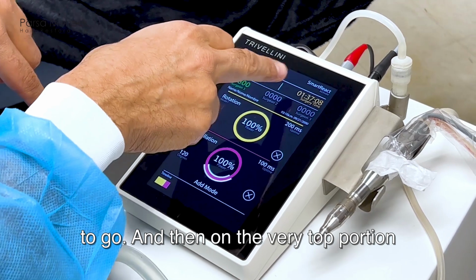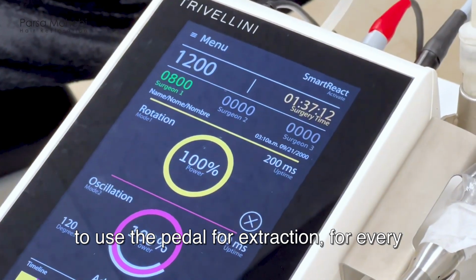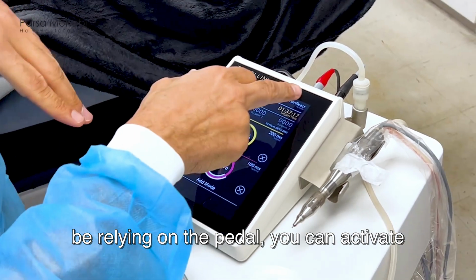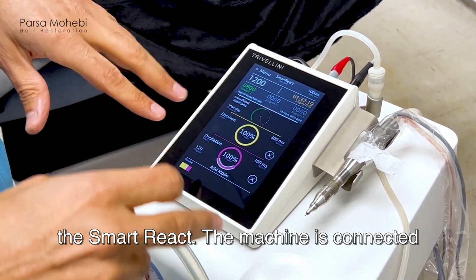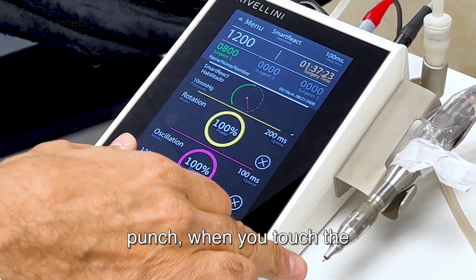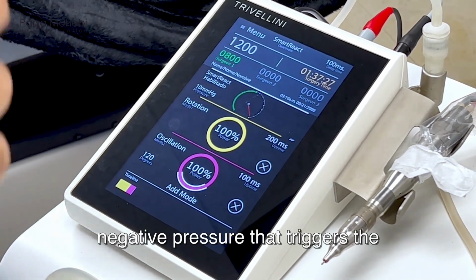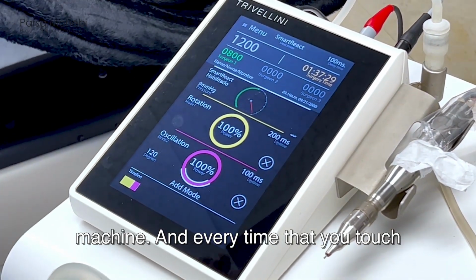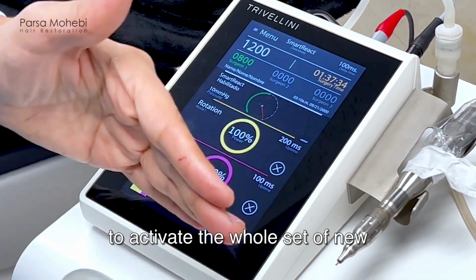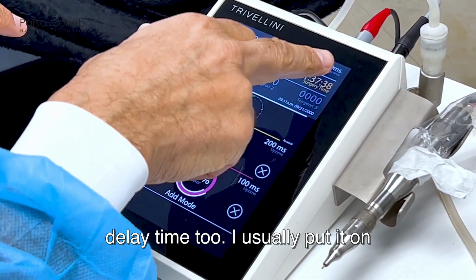And then on the very top portion, we have a Smart React. If you don't want to use the pedal for every extraction, if you want to not be relying on the pedal, you can activate the Smart React. The machine is connected to the suction system. So when the tip of the punch touches the skin, it creates a negative pressure that triggers the machine, and every time that you touch the skin, the machine knows that it has to activate the whole set of new modes. So in this case, we have a delay time too.